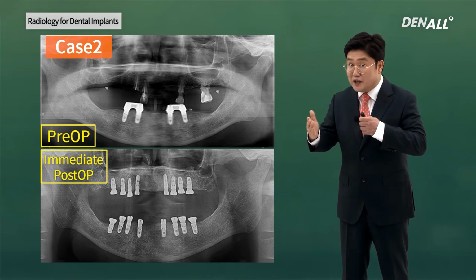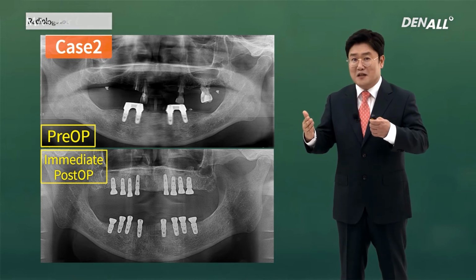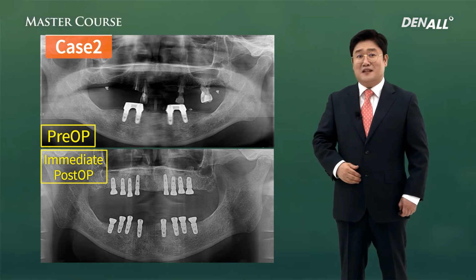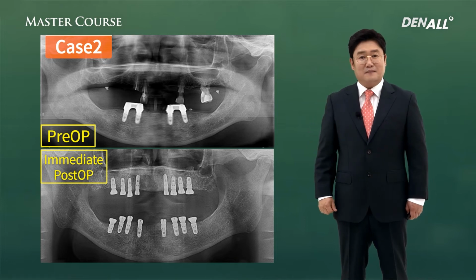The advancement of CBCT led the development of implant surgery. Thus, CBCT is a very important radiological procedure.